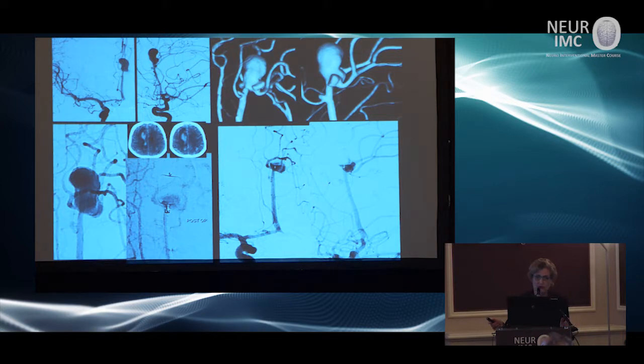And this was more terrible. This patient presented with big hemorrhage, and the aneurysm is really ugly. So we decided to put a WEB device so that there will be no worry about coil protrusion, to save the acute period.